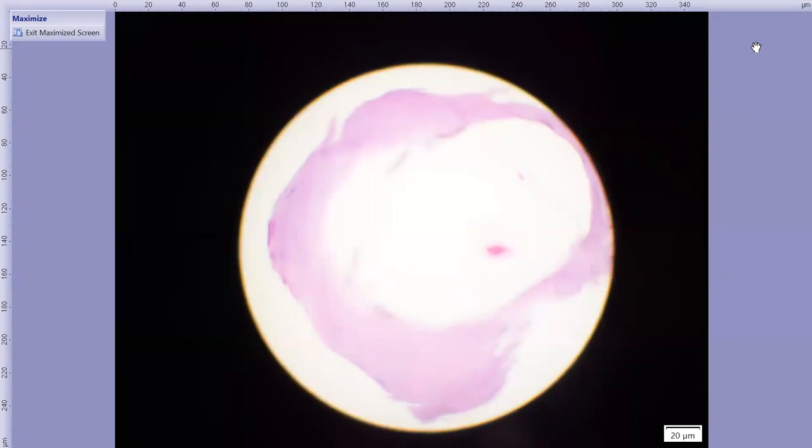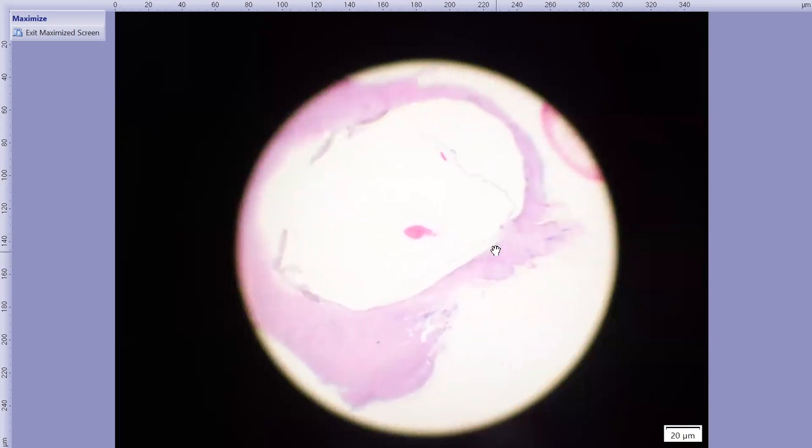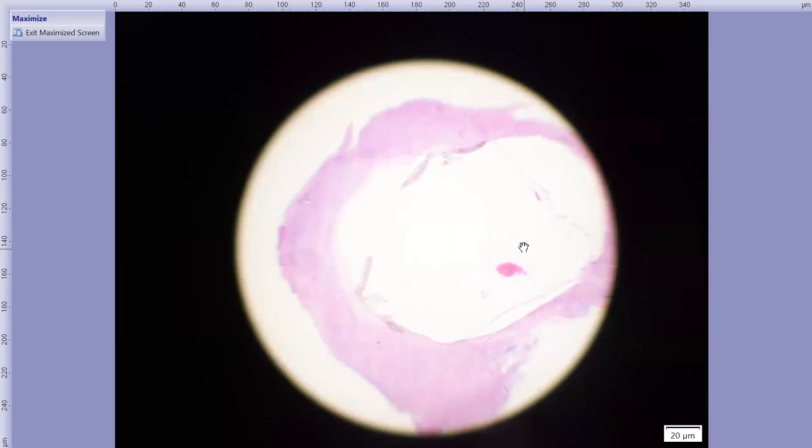All right. So here's our subgross view. In this particular section, we actually didn't sample the lens of this left eye, but it was there somewhere. And that was not the most important part of this case. So here I have the cornea pointing to the left. Here is an iris leaflet. Here's the other iris leaflet. You can see the retina is detached. There's a little bit of hemorrhage in the vitreal space. And the optic nerve is sampled here and it is abnormal. From this view, you can see how greatly expanded the sclera is, and also the cornea is completely effaced. And you can appreciate there is, once again, some normal deep corneal stroma that's still present and identifiable.